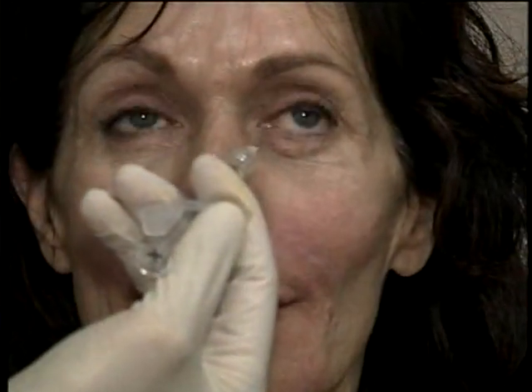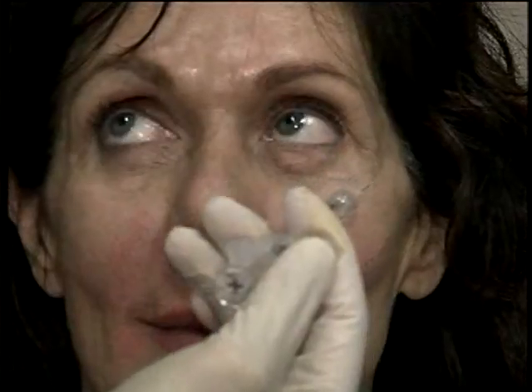So now I'm going to treat the region, the nasojugal groove right here, and infraorbital hollow. What I do for this is I march the product out along this region. I'm using Restylane with the 30 gauge needle, and the reason why I'm using a 30 gauge needle is because I want to deposit just a little bit. You could use a 32 gauge needle, but I find it very difficult to squeeze it through there, but that is an option. I like to place the product very deep. I think it works better if you place it deep.